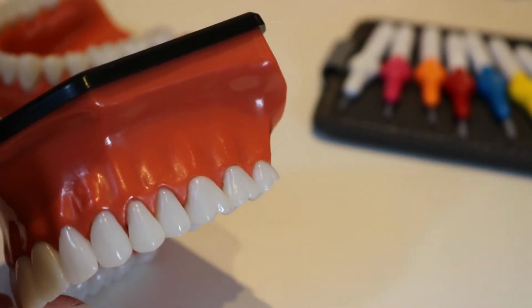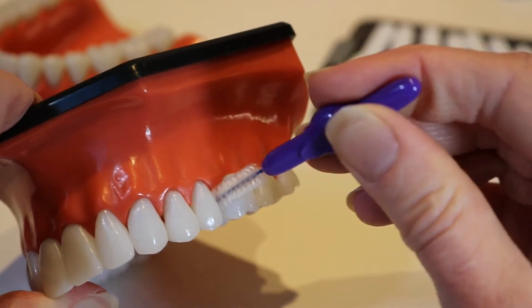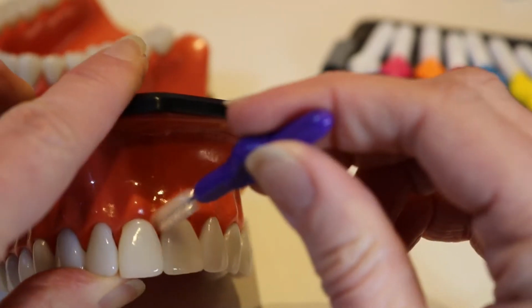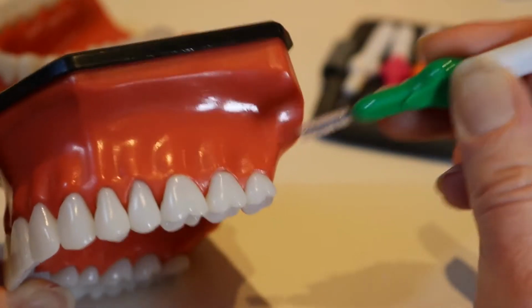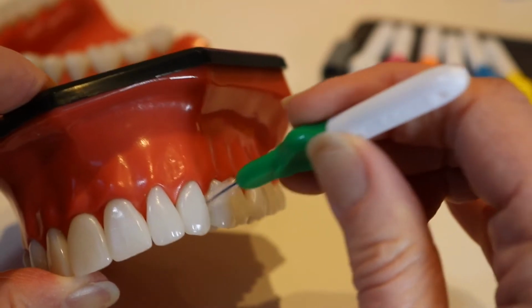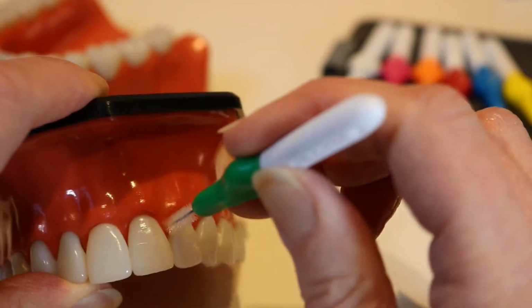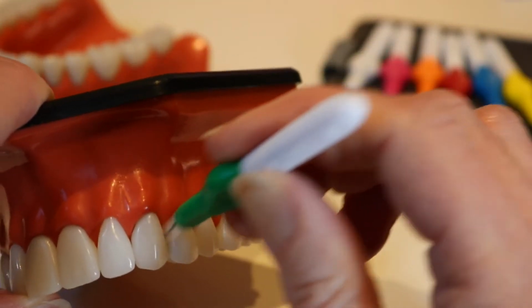We're going to move down to the purple. Here we are. So we start with the biggest size, moving down and seeing if any of them will go in without being forced. I'm just doing one size just for quickness to show you. So we're on to our green one, which is the next size down. And the green one goes through quite nicely through the gap there. But that's all. So we've got the green one for this gap here.